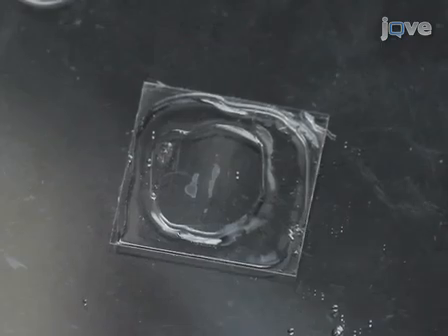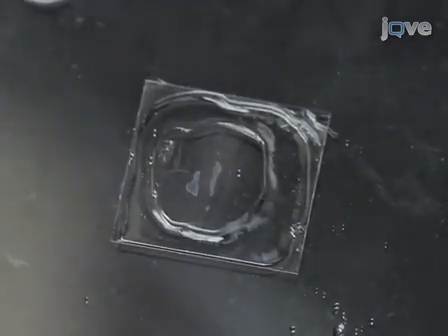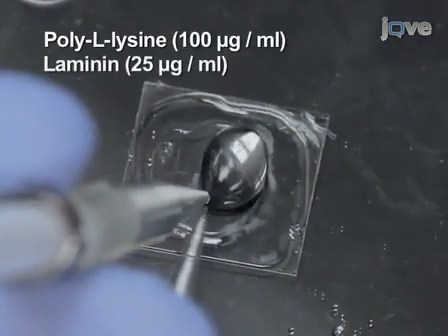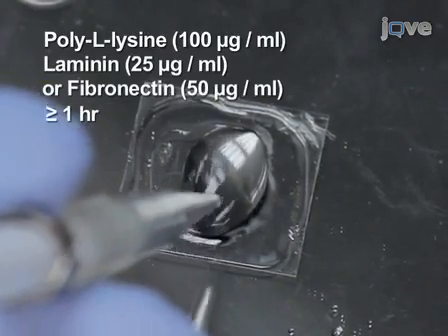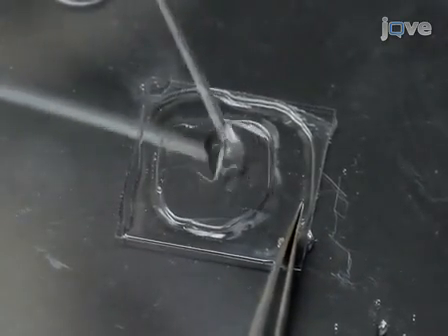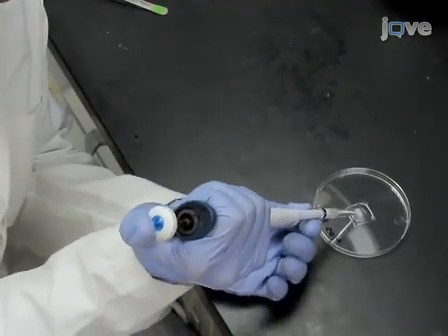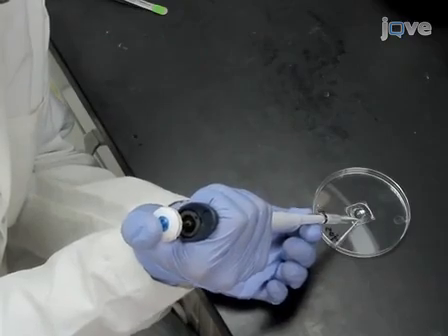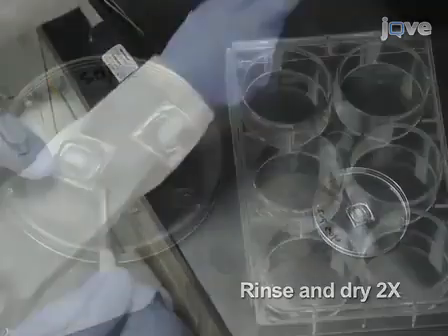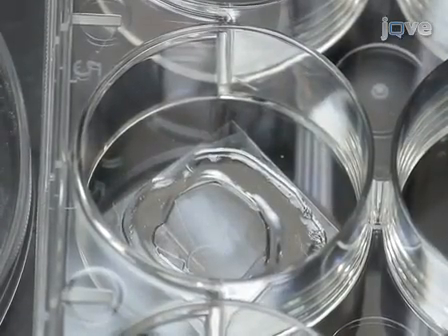The electrospun fibers and glass controls need to be coated in protein prior to cell culture. To do this, cover the substrates in poly-L-lysine, laminin, or fibronectin for at least 1 hour. Then, aspirate the excess solution until the substrates are dry. If poly-L-lysine is used, the substrate should be rinsed in sterile water and dried twice following the initial coating. Once they are dry, place the substrates in 6-well tissue culture plates for cell culture.